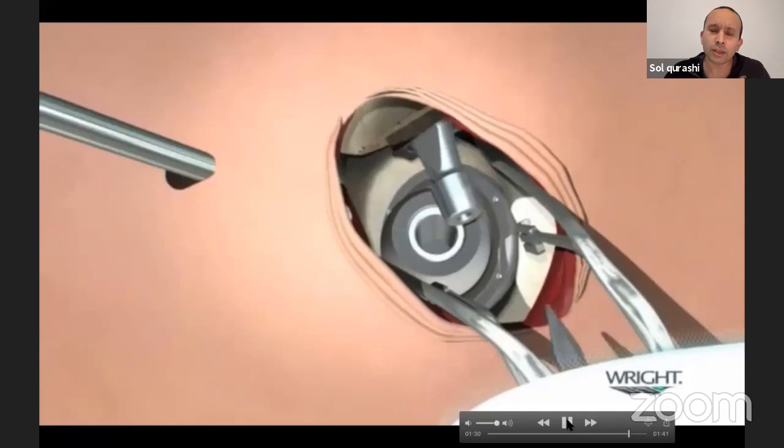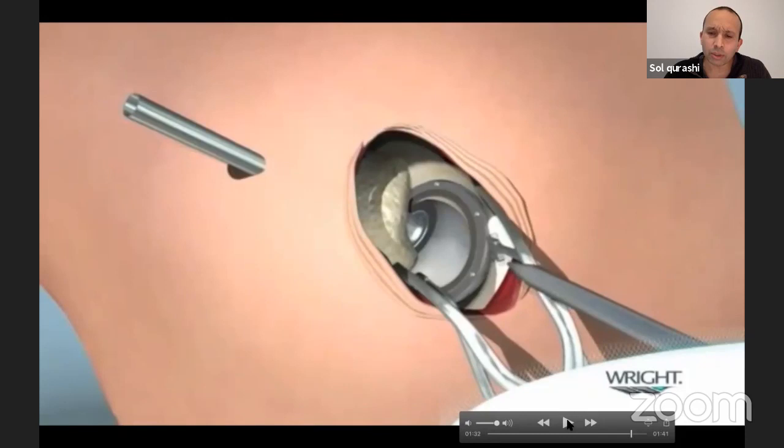And the reason we do that is because if you've preserved all that soft tissue envelope, you can't actually put the head in and rotate it back in. It doesn't allow you. And for the same very reason, if you can relocate something, you can dislocate it the same way. But once you put the head in and then traction it, trying to get the neck into it, and it engages into the taper, it's supposed to create almost a non-dislocatable construct. I'm sure if you can push hard enough, you can dislocate it, but we test it pretty vigorously on the table. And the aim is that this should not dislocate in this patient's functional range. And you look for impingement and the usual stuff that you look for in stability testing. And I'll show you a video of what we normally do for every patient for stability testing.